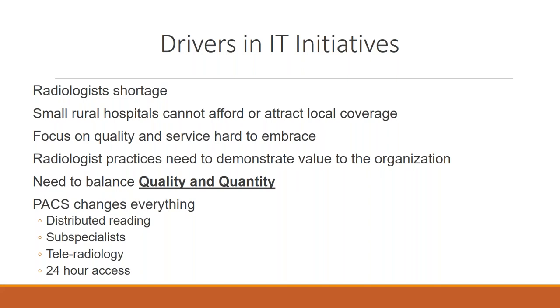So you take these mega systems that have numerous physicians and skill sets, and now they're at the fingertips of any particular practice. And that's sort of the world I'm in today, and that's taking that practice to hospitals, whether they be large or small, and being able to distribute those images to the right doctors.